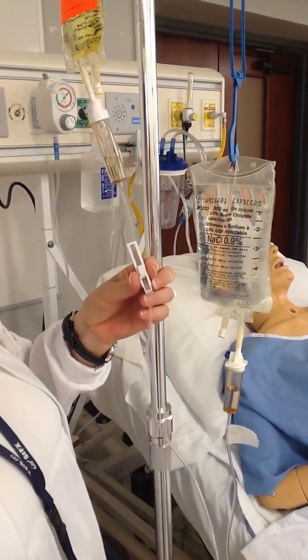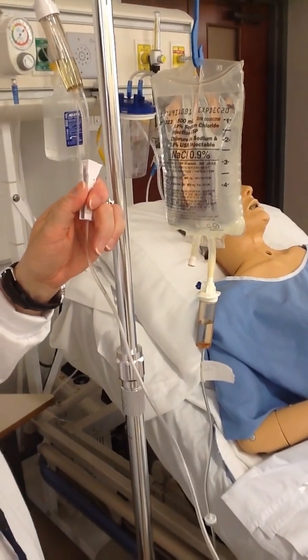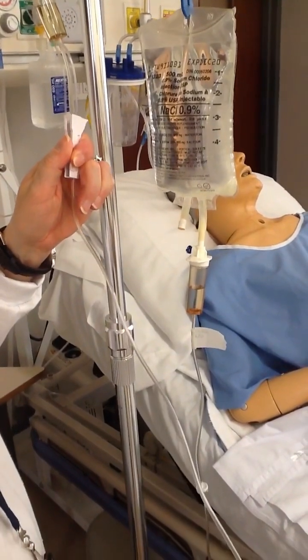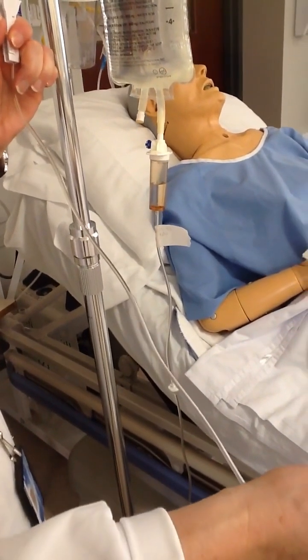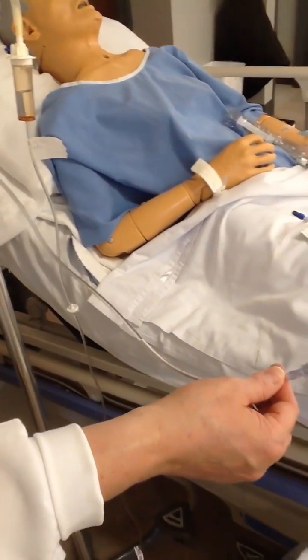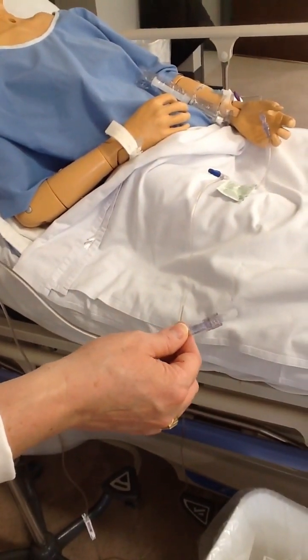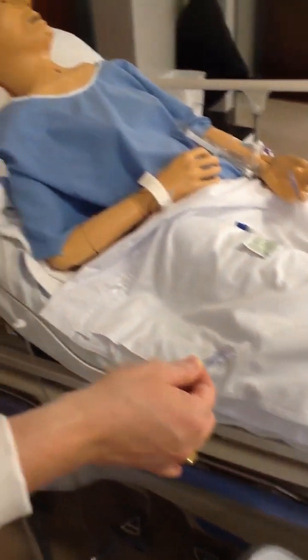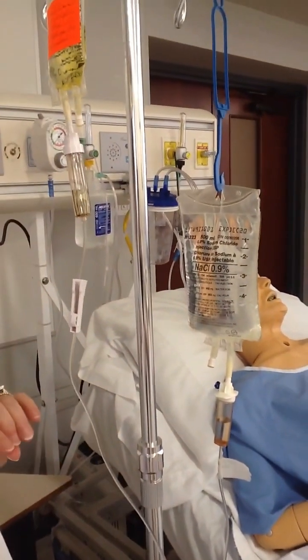So go slow. Take a minute to prime so that you don't lose a bunch of minutes trying to get out your bubbles. And we don't want to lose anything, so I'm going to let this come to the end. You can see there's not a bubble in there. And I'm just going to let one little drop fall out, and I'm just going to shut that right off. So that's all nicely primed and ready to go.